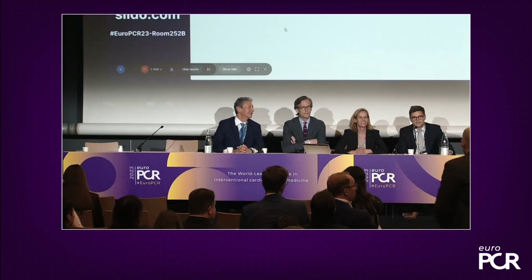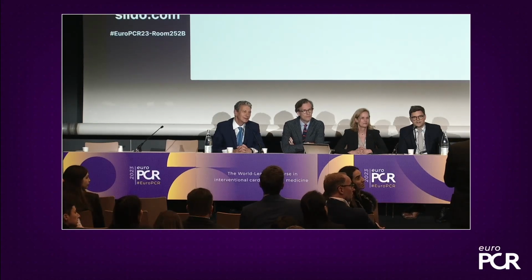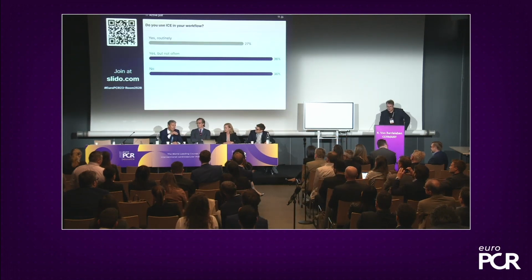Yes, please. Hi. Is it possible or feasible to sterilize the ICE probe, to reuse it or not? Sergio. Not in Italy, and I suppose not in Europe.